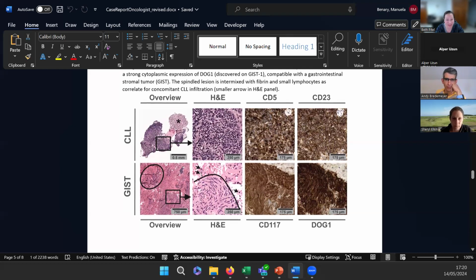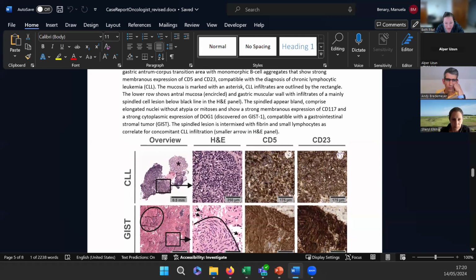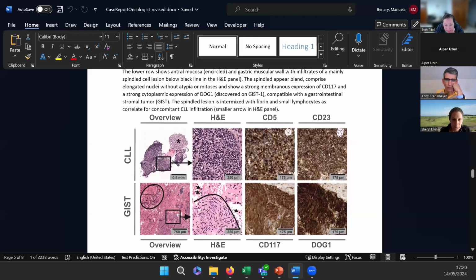So we do have some stainings on H&E. And the H&Es look very different to me.